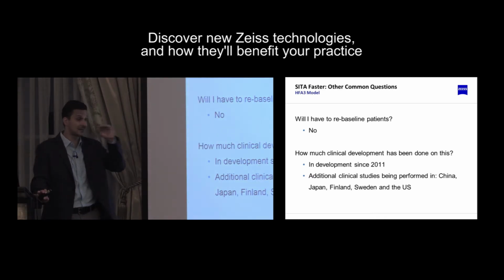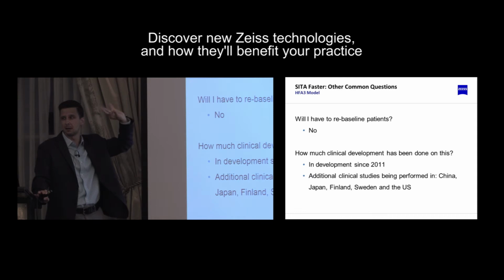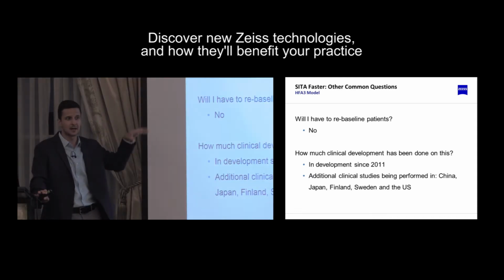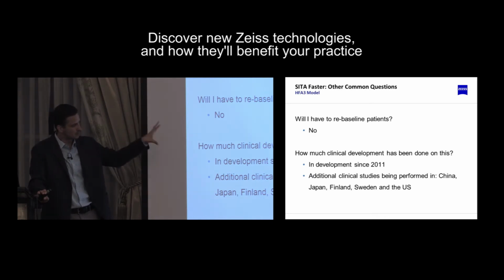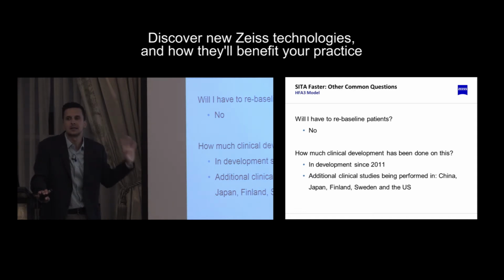The other piece is that the testing has been in place since about 2011. And you should also know that the Clarus has been out there for about 3 years in R&D and clinical development, so that's not a new device on the market either. It's just that refining some of those protocols and algorithms took some time. But with Sita fast and Sita faster, you're now looking at a quicker clinical test. With a typical patient who's ready to sit for a visual field, you're about 2 to 2.5 minutes. You're probably closer to 3 minutes on a patient who has a little bit more struggle with taking the test.